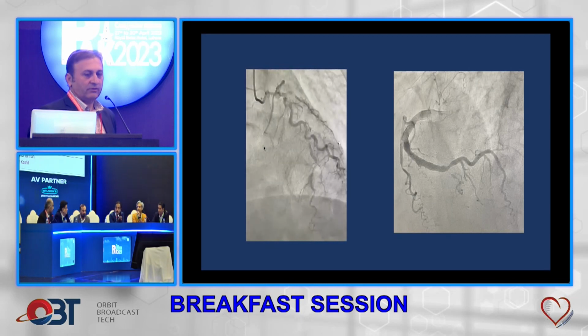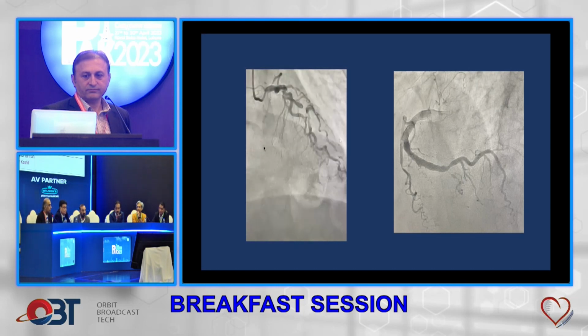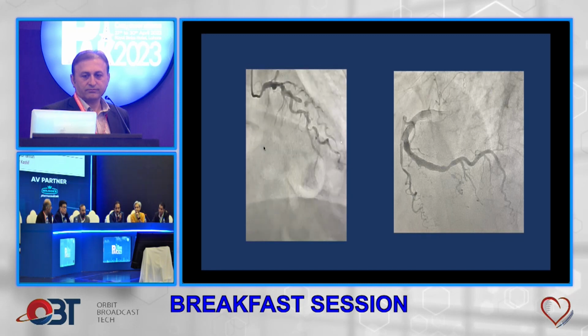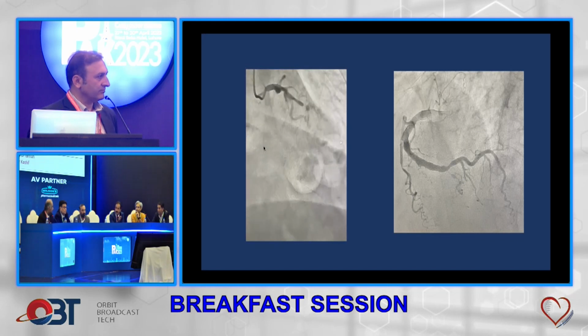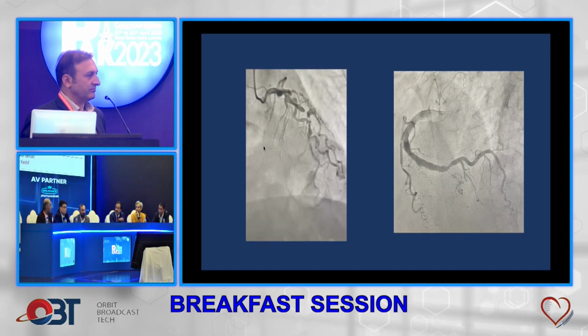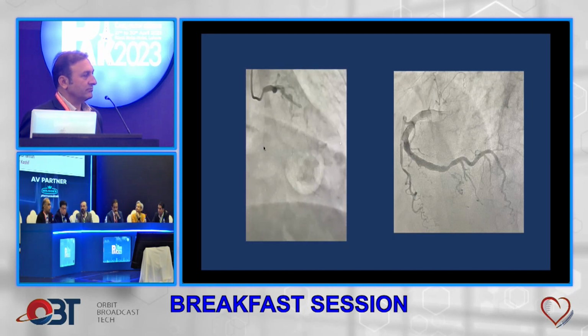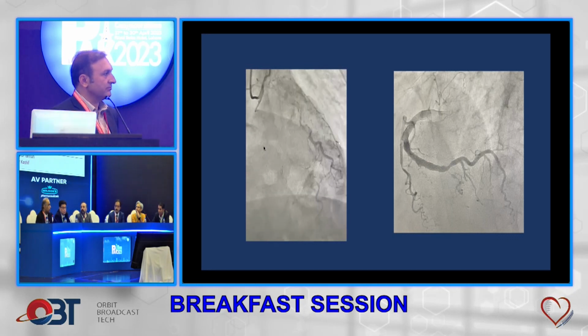Then also the balloon, I know you'll have to use like a 1.5 or 2.5 balloon to keep it central, but the likelihood of causing a dissection, to me, would be more if I go that close to the lesion, and if I am not in the right place, then it's going to go under the plaque more likely than anything else. Another thing about our problem is that many times we're faced with the economics of the whole thing.